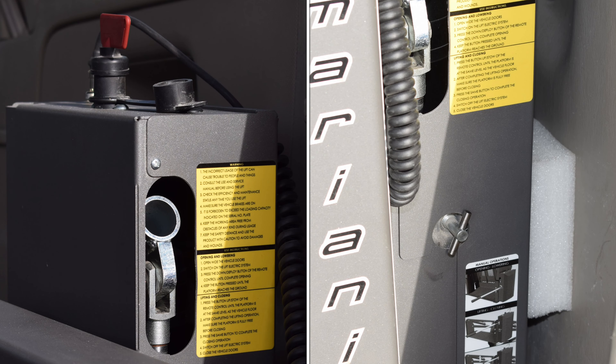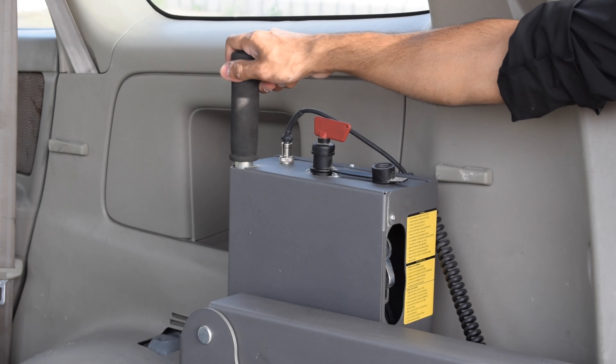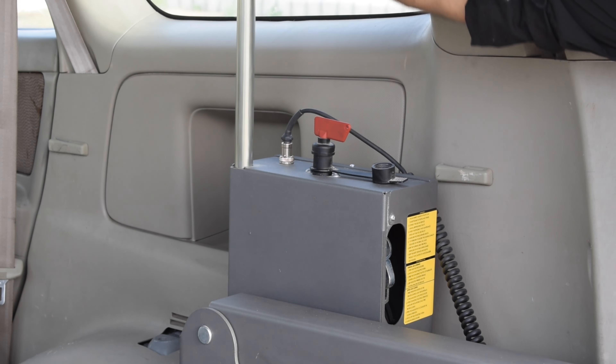When it comes to electronic things there is always a chance of uncertainty, which this lift eliminates by introducing the manual pump and tap, which allows usage of the lift in case of electric system failure with the help of the supplied pipe into the dedicated housing.